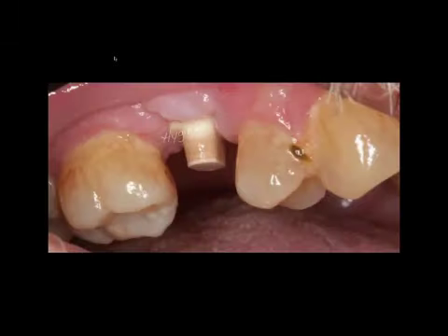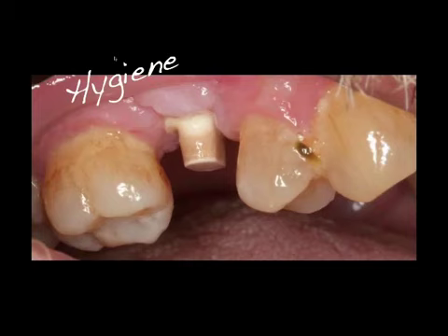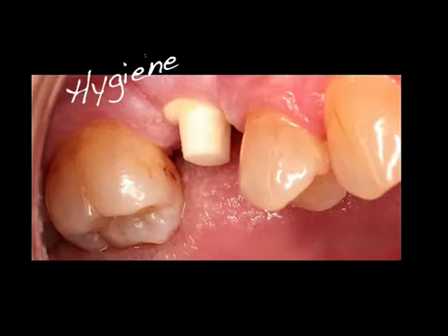Now, of course, keeping these implants clean and keeping the sites clean is extremely important. There's no miracle in implant dentistry that's going to overcome bad hygiene, and tissues get inflamed around these implants as well. If somebody is prone to periodontal disease, we have problems around these implants too, but they are less common and less destructive than what they would be like around titanium. So hygiene is always of utmost importance.